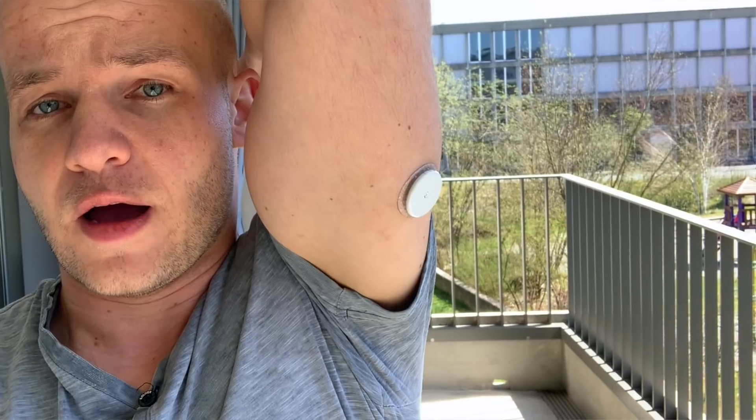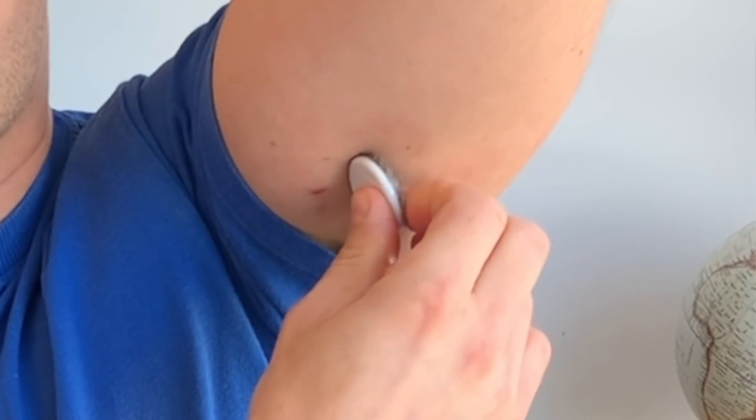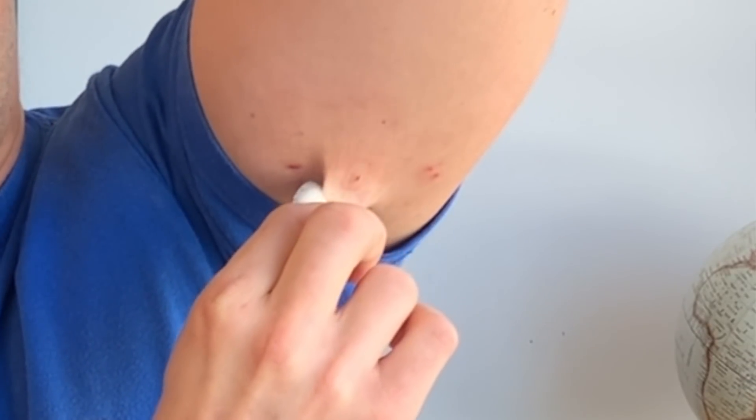Another reason to stay away from Freestyle Libre is that the sensor is attached to your body 24/7 and you cannot take it off. Well, technically you can take it off, but when you do, you won't be able to put it back on — so you've essentially thrown away all the money you paid for the sensor. If you don't want something attached 24/7, then the Freestyle Libre really is not for you.